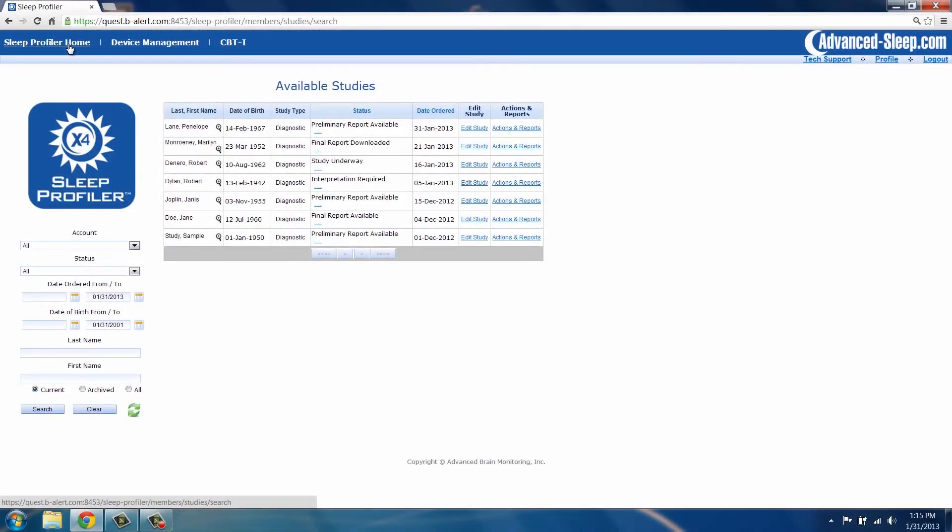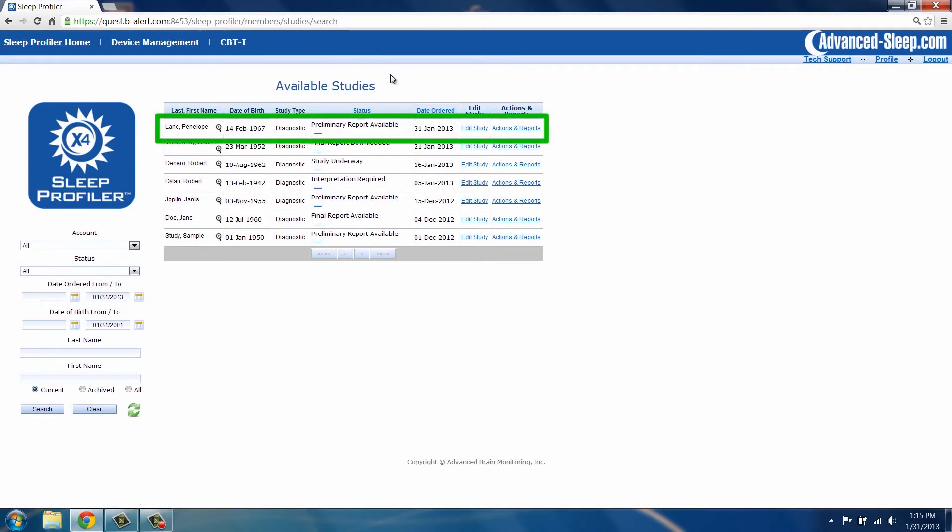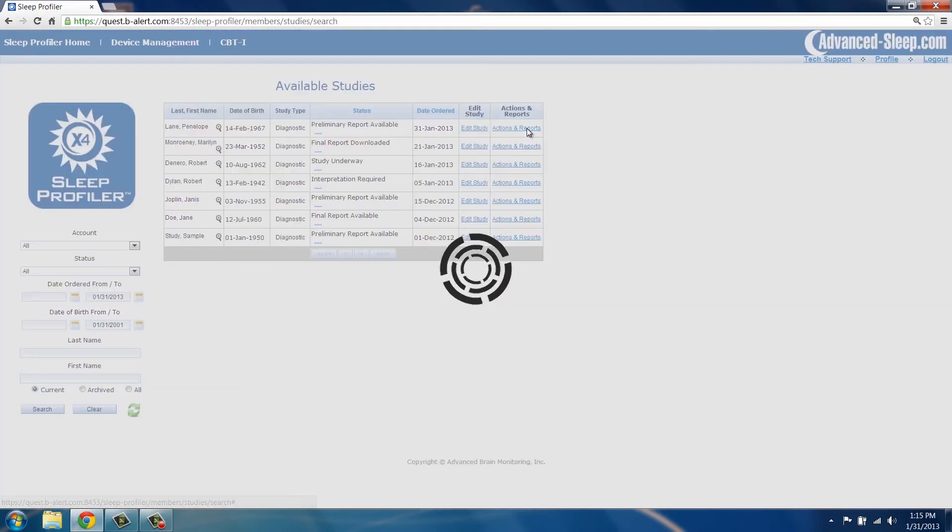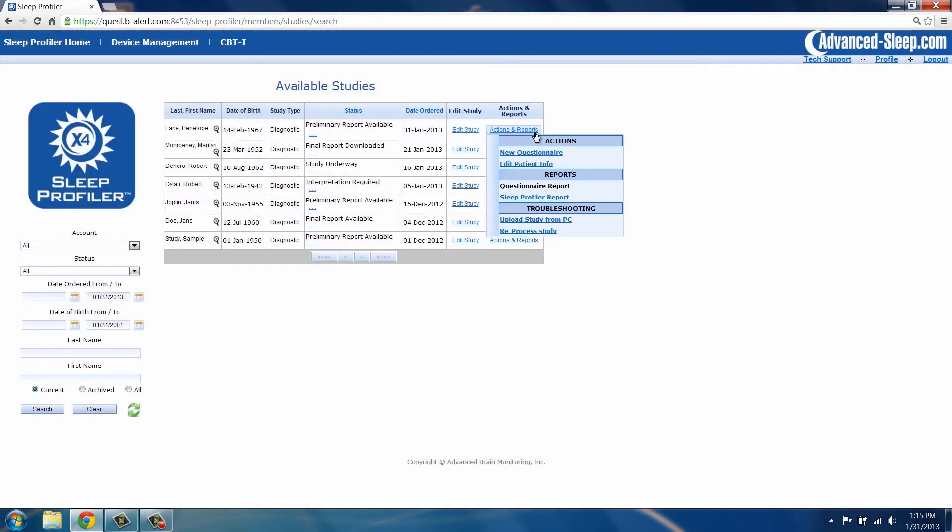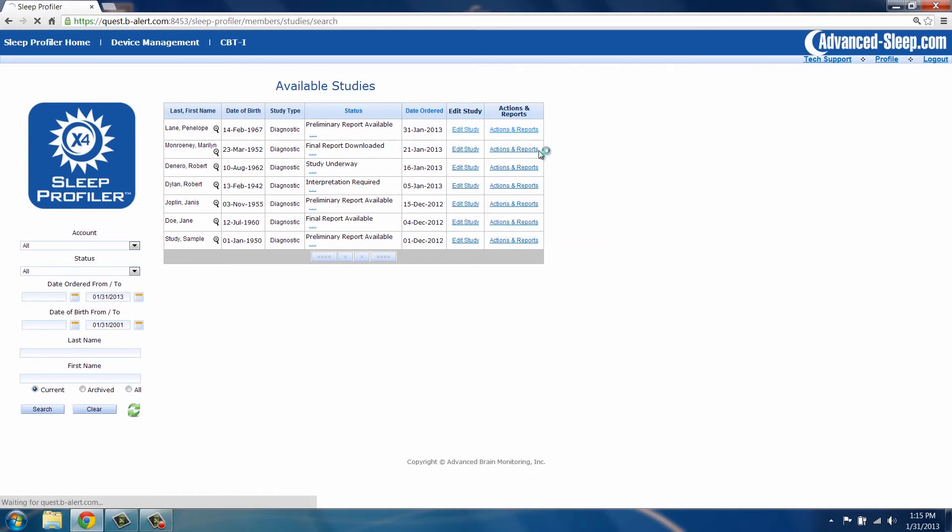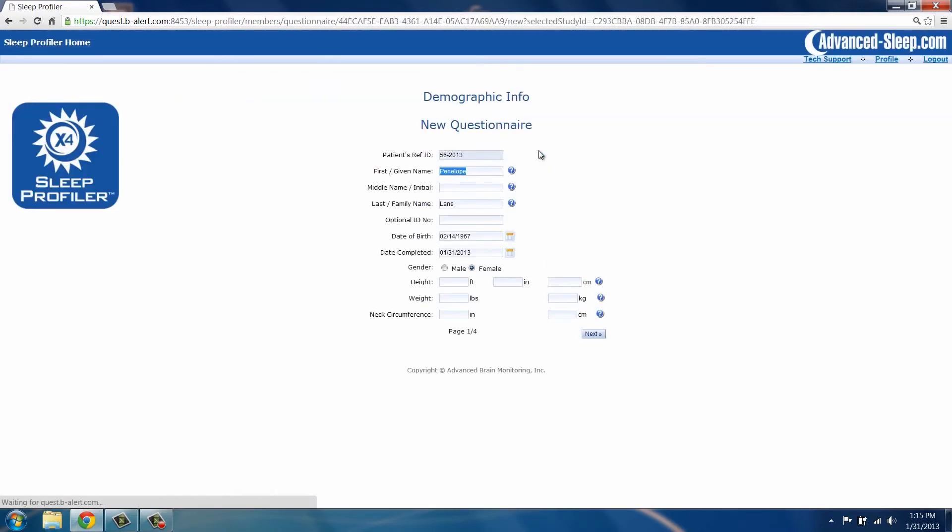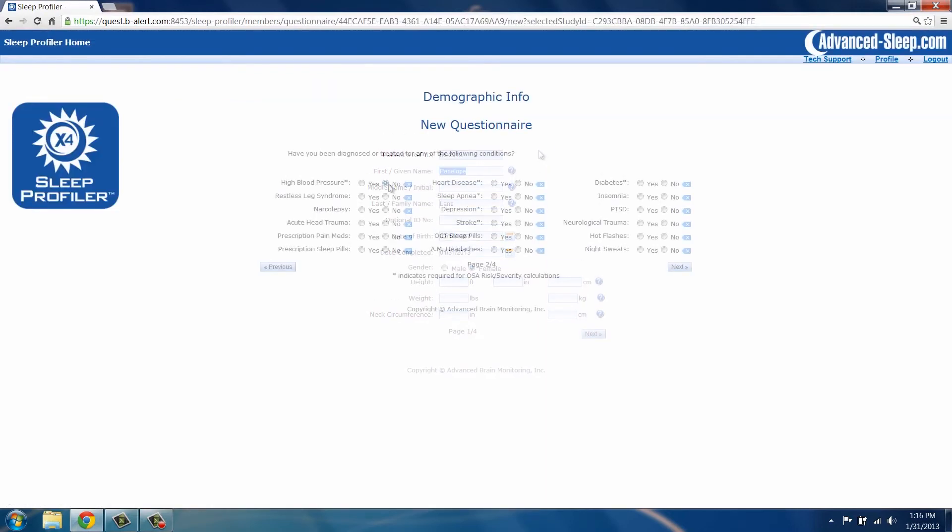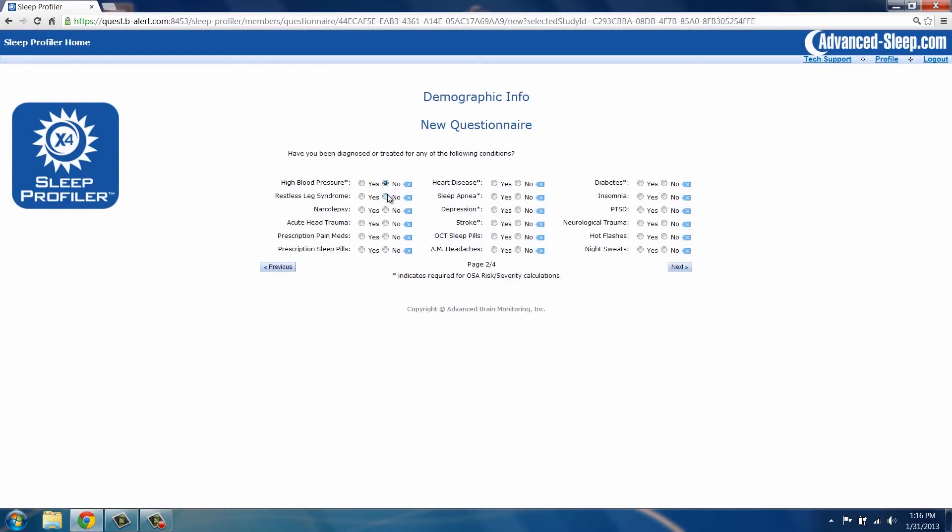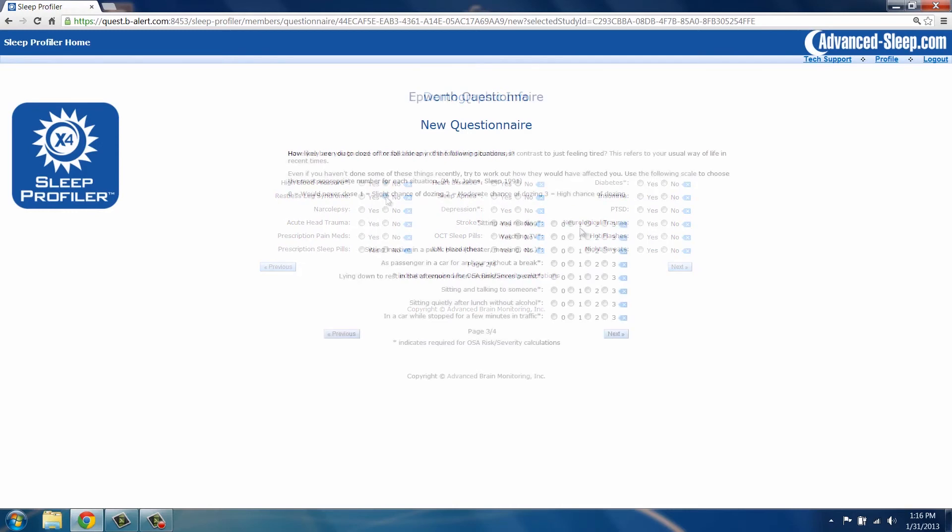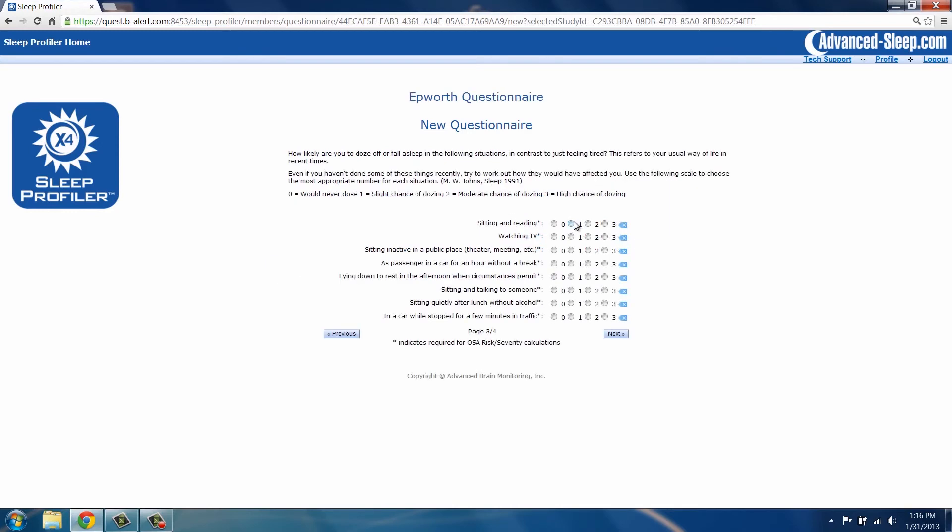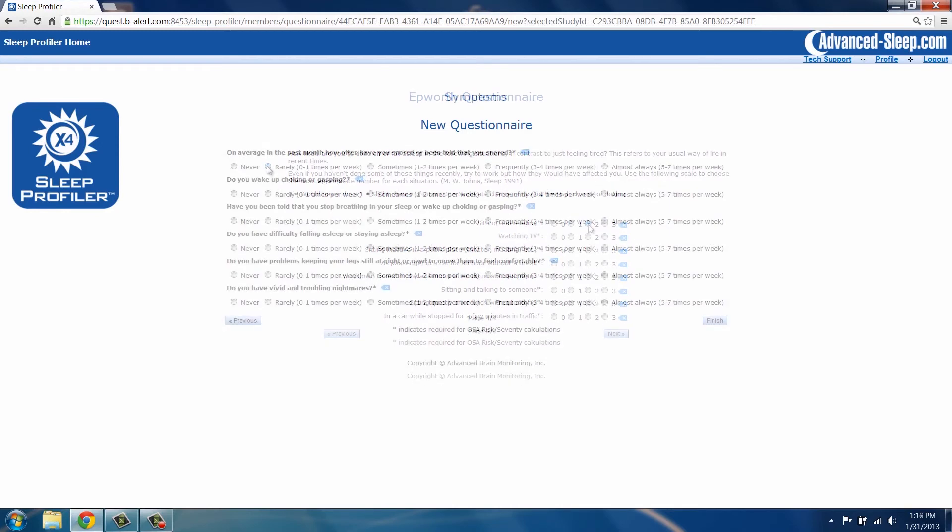To enter questionnaire information for a study, locate the patient name in the available study list. Select Actions and Reports and click on New Questionnaire. Four screens will be presented in order to input patient responses from the questionnaire.